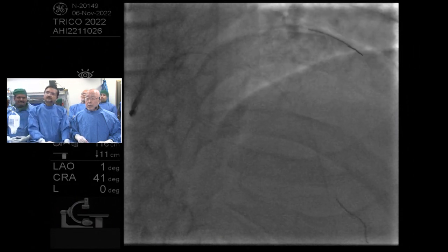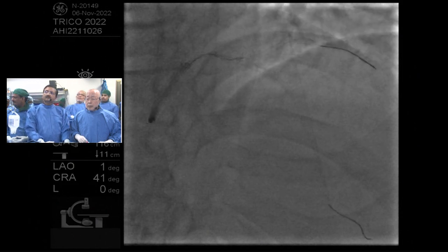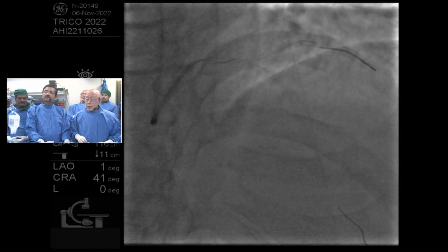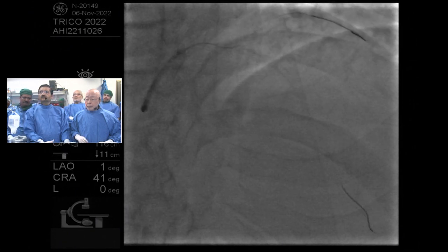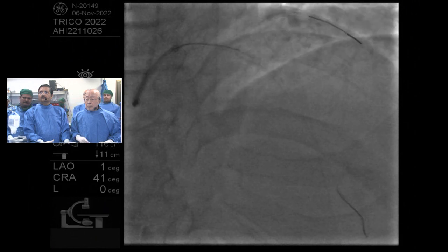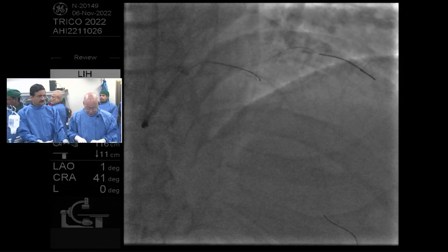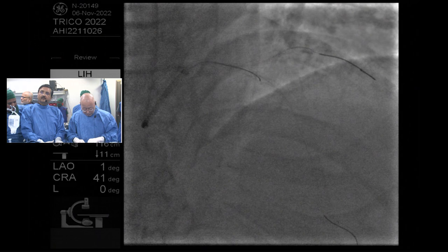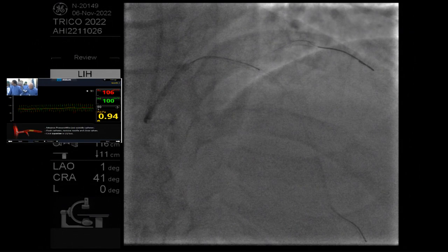And so let's see, but the challenge is, Alvin, correct me if I'm wrong, where you were going with your initial comment is, I think the FFR will be negative, but are you really comfortable leaving an ostial LAD that looks like that? Yes. Especially when the circ that you have to cross is not so important. Yeah, okay. I'm totally in agreement there, right? And that it makes me uncomfortable. But this yet again goes back to the idea that when you image early, you get to avoid these difficulties.